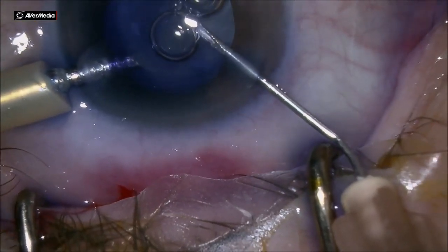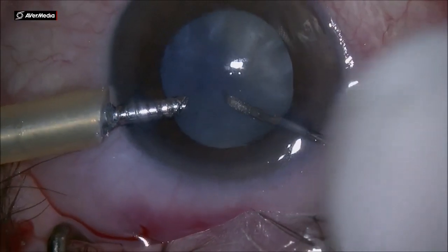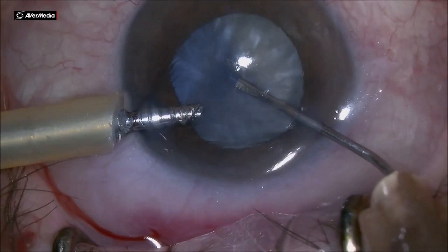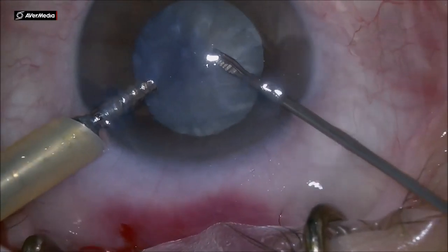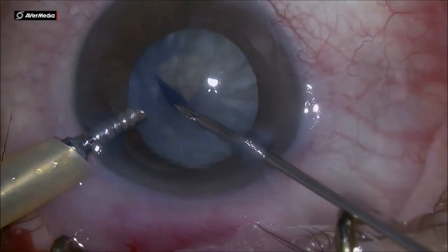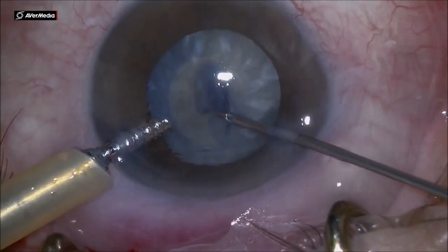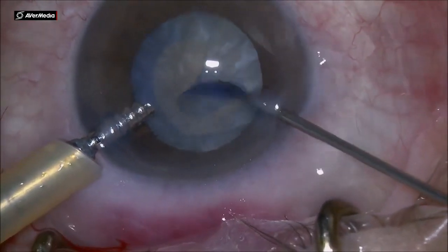It's done in sub-Tenon's anesthesia. Using the cystotome, I start by incising the capsule and aspirate a little bit of that fluffy cortex to release the pressure into the bag. Under irrigation from the AC maintainer, a round capsulorhexis is fashioned — it's a little bit small, on the smaller side, but enough to be able to take out the nucleus.